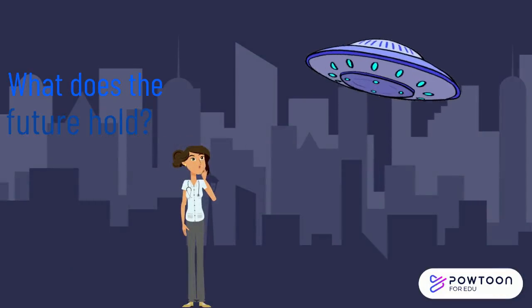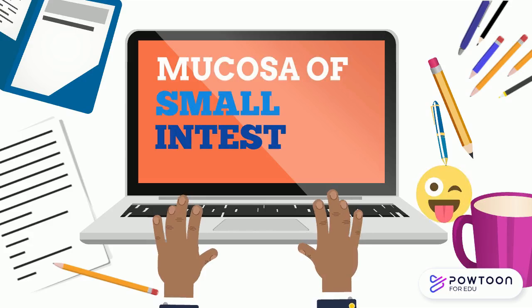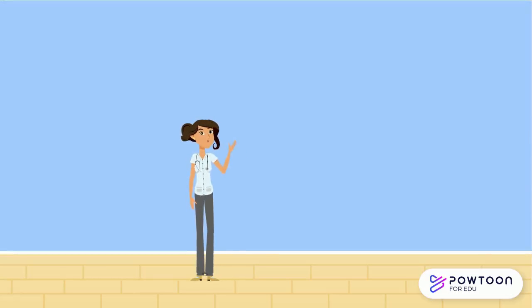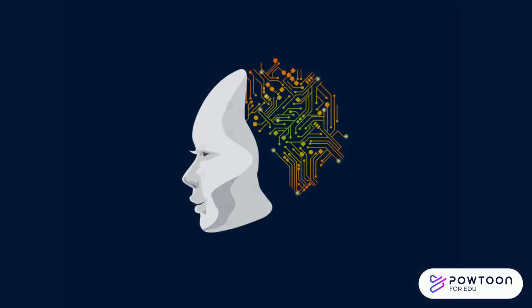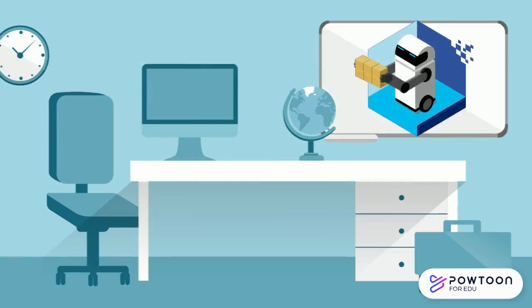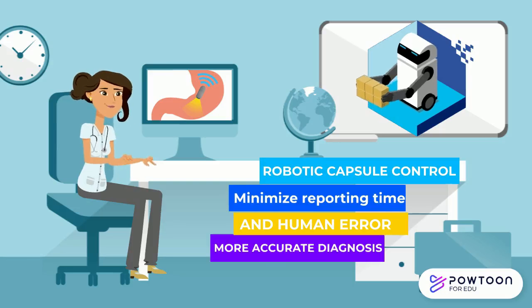Since its initial fruition in 2001, video capsule endoscopy has paved the way for gastroenterological examination, allowing doctors to directly view mucosa of the small intestine for the very first time. Despite this, there remain great challenges limiting its widespread use, specifically the detection of the capsule's location within the body as its greatest engineering challenge. However, within the near future, scientists are working to utilize artificial intelligence and machine learning technology to combat this limitation. This could proliferate to even encompass robotic capsule control within the abdominal screening process to minimize reporting time and human error for more accurate diagnosis.